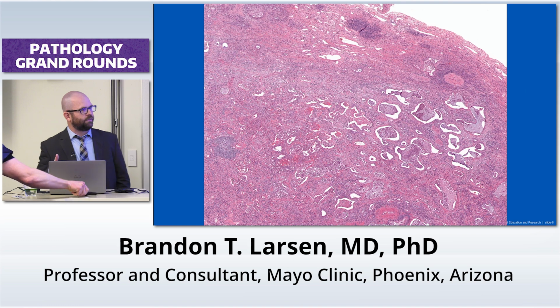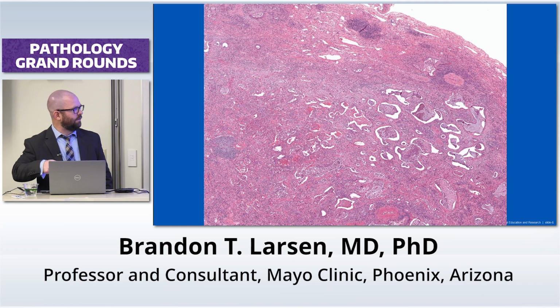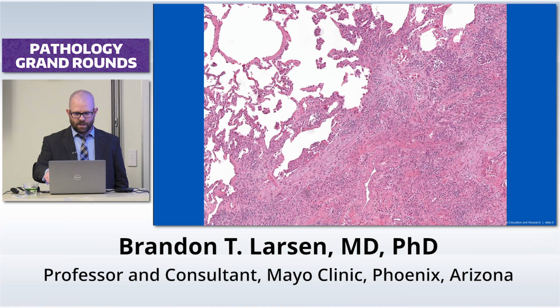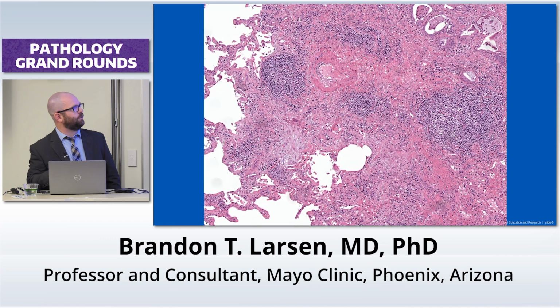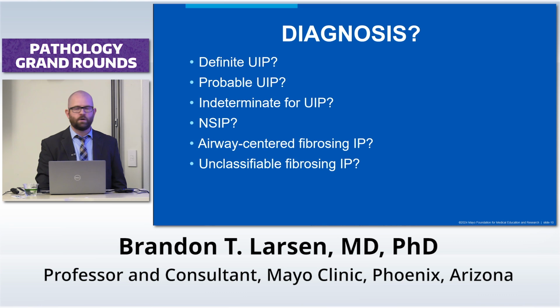Coming in on another area, you can see there's a pretty diffuse cellular interstitial infiltrate, a diffuse mild lymphoid interstitial infiltrate. Other areas, again, prominent germinal centers, and then fibroblast foci, again a classic appearance of a fibroblast focus at the interface between destroyed fibrotic lung and adjacent uninvolved lung. One more image here of prominent lymphoid hyperplasia within this fibrotic process. So this is your case on your desk.